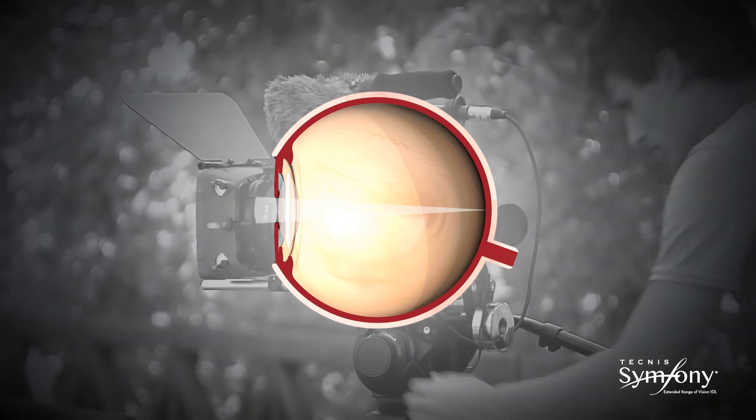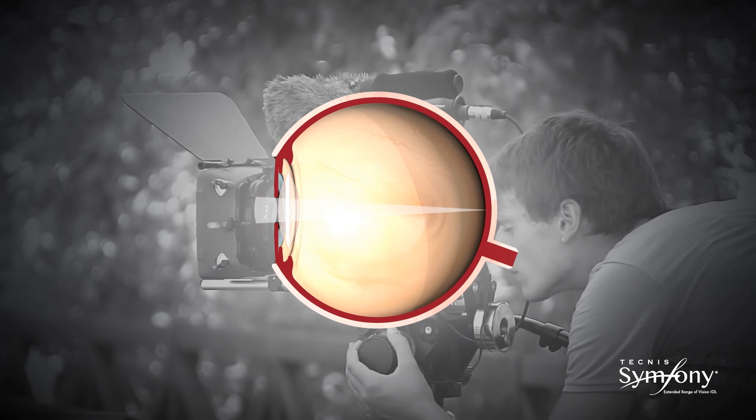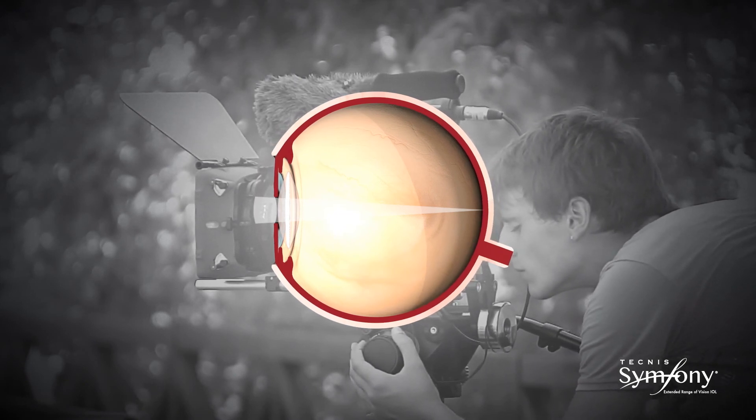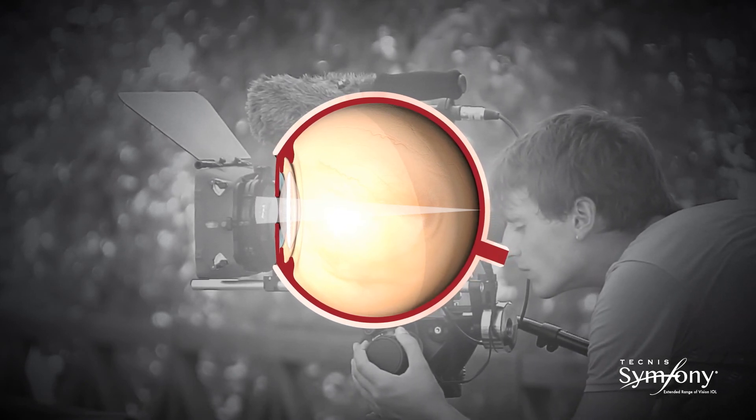This is similar to examples in the photographic world, where refractive and diffractive lenses are also combined to correct chromatic aberration.